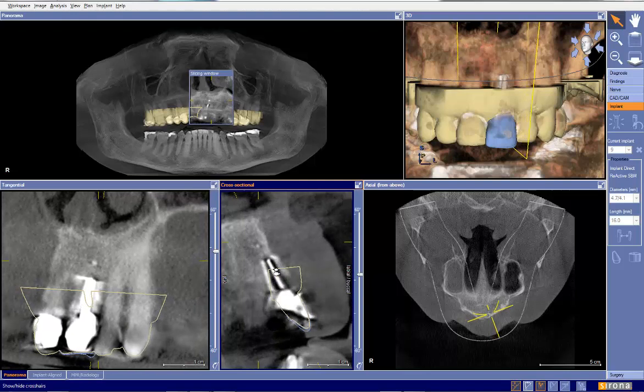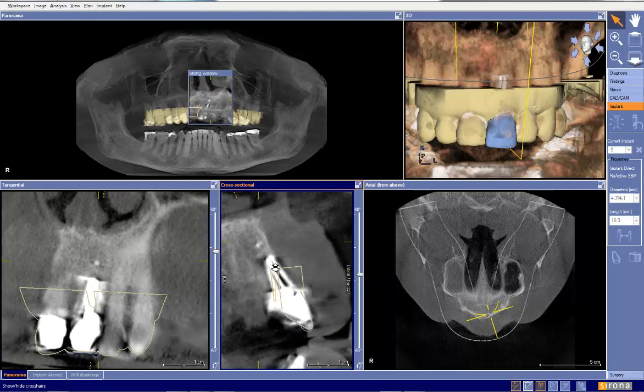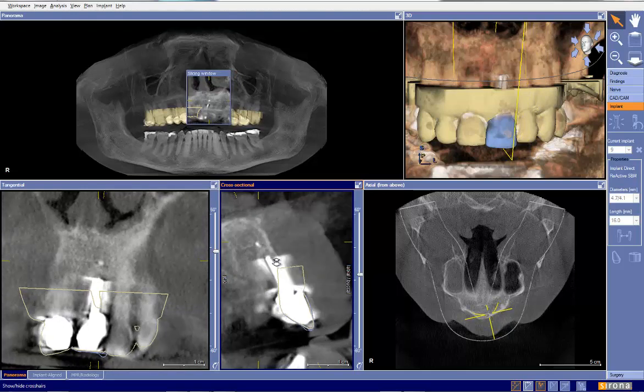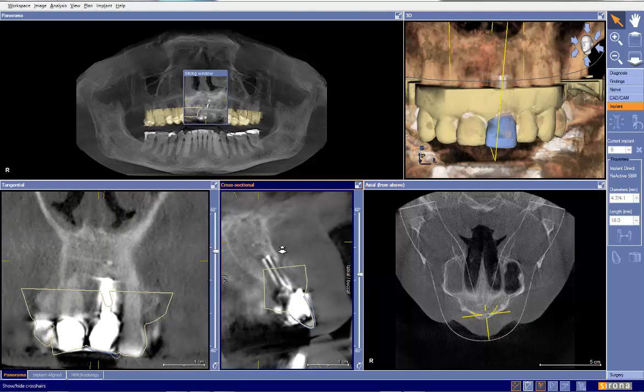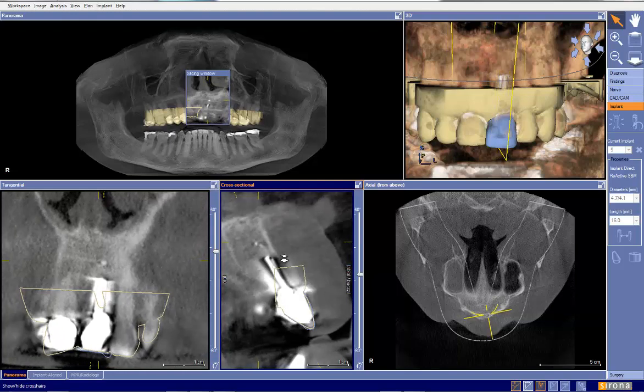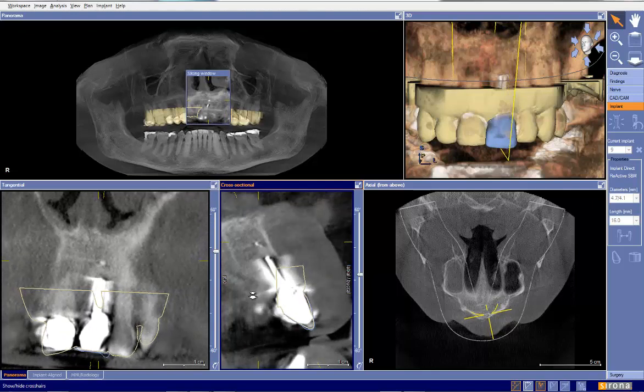And when I see something like that, a lot of red lights go up for me. This can become a very aesthetic disaster or an implant disaster. So if I am not certain of where my buccal plate is, this is definitely a case for pre-implant grafting. Take the tooth out, graft the case, retain the tissue. We have to graft and regain a new buccal wall. So this is certainly not an easier case. Connective tissue grafting is a possibility. Tissue biotype is going to play a role in this.